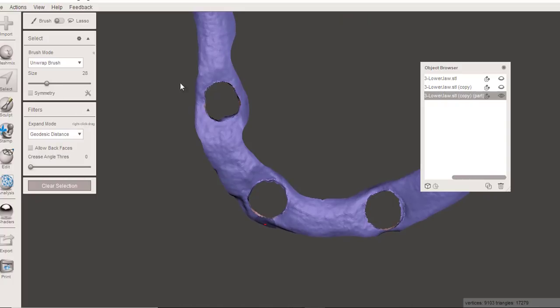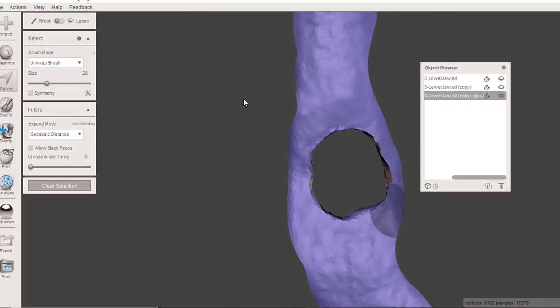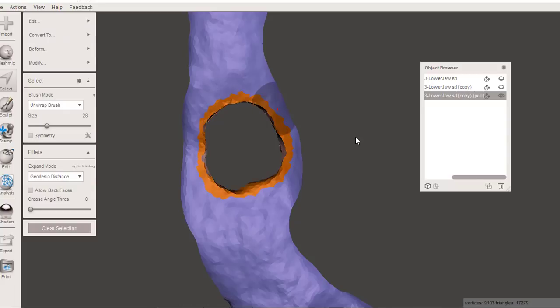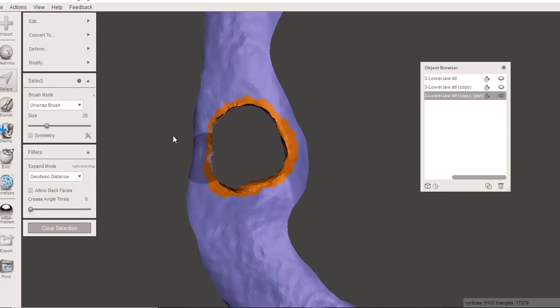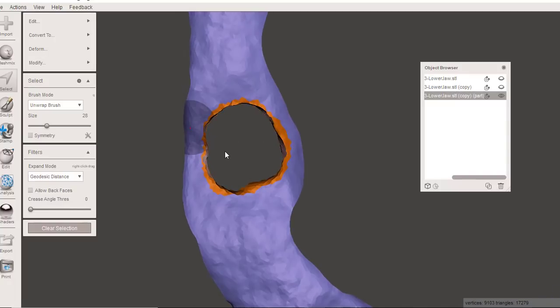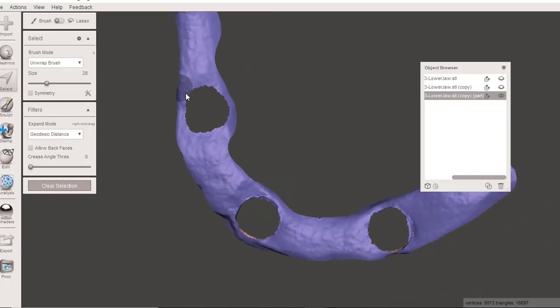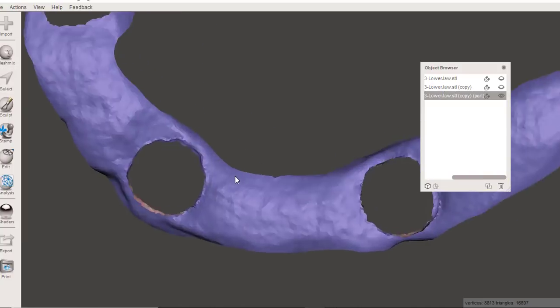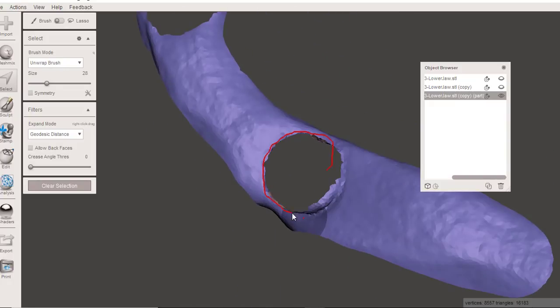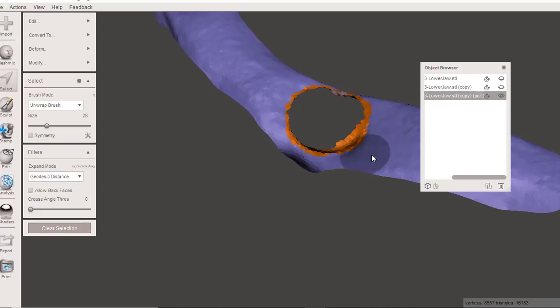And now I want to go just a tiny bit more. So I'm going to start from inside that circle. I'm just creating a little buffer space around this so that it has room for a path of draw to come on and off. And if it looks like it's a little too excessive, you could come to modify and contract the ring. That will pull it back by one triangle in all directions and then delete it. And same thing, contract and delete.